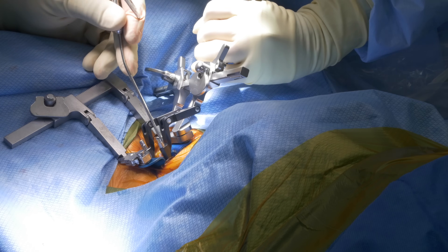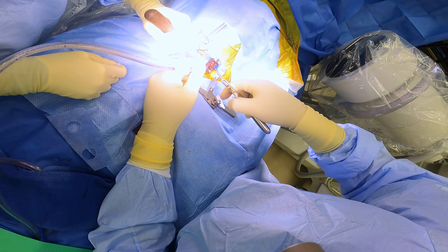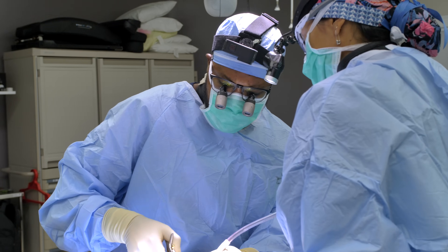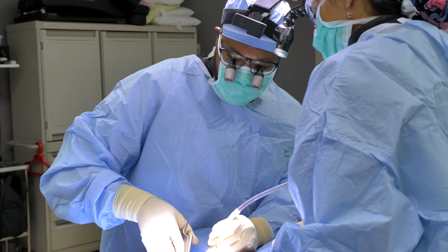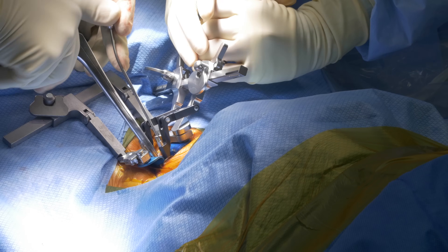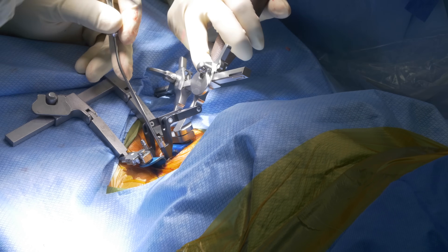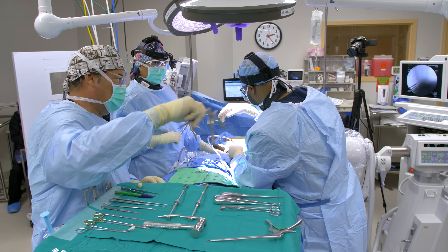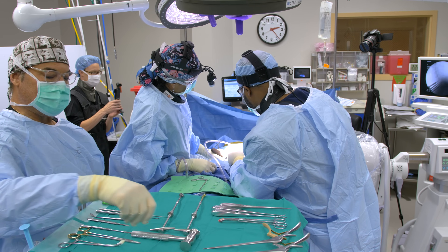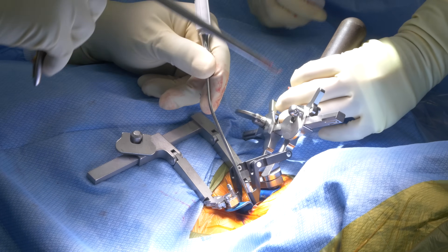Right now I'm just removing this bone here — it's at the posterior aspect of his vertebral body, kind of at the end plates posteriorly. What this does is it gives me a great view of his spinal cord, which is right under there, and that's where he has all the compression. I'm just working my way across, moving all of the posterior aspect of the vertebral body that's compressing it — working right on top of the spinal cord here.